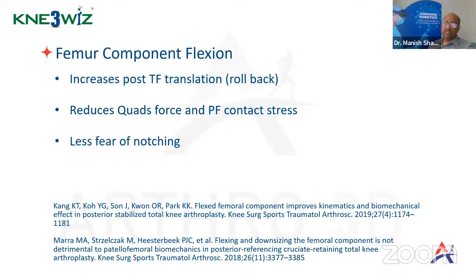Femoral component flexion increases posterior tibiofemoral translation, or the rollback. It reduces the quadriceps force and the patellofemoral contact stress, and there is less fear of notching.